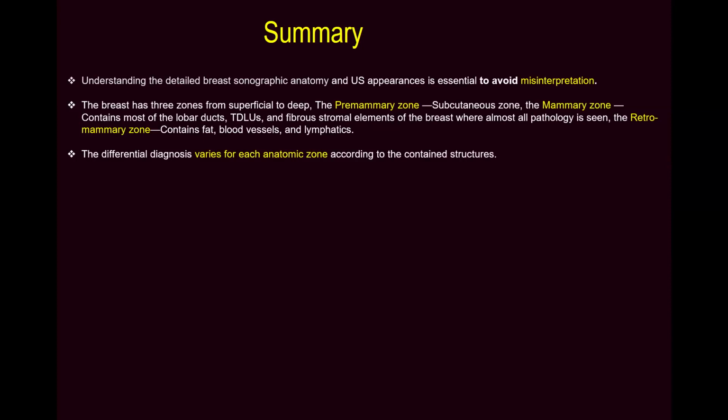The differential diagnosis varies for each anatomic zone according to the contained structures, as we have mentioned.